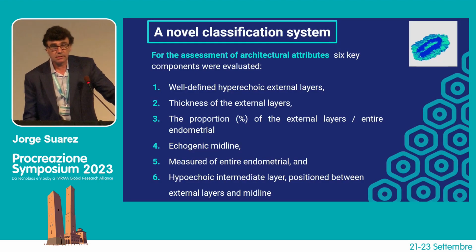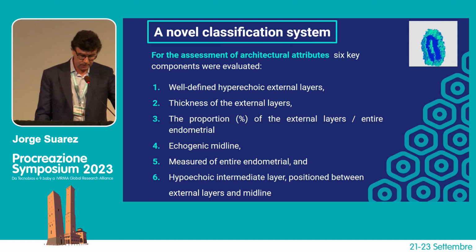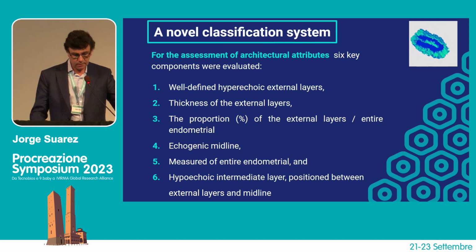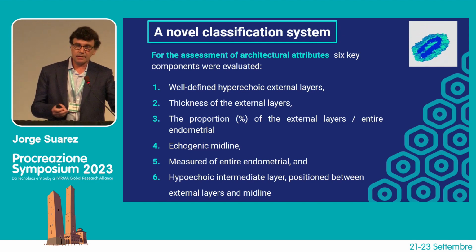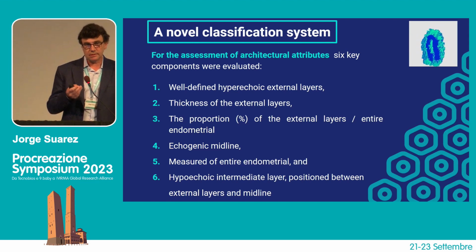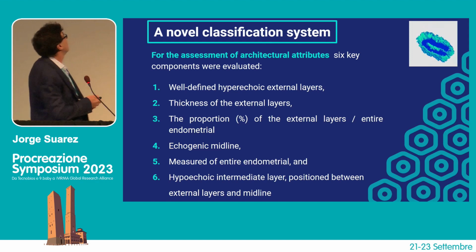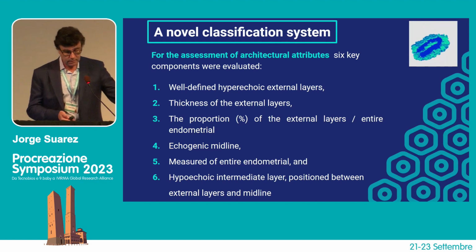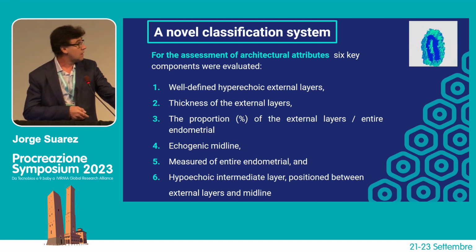So, taking into account this previous hypothesis, we can go for assessment of the architectural attributes that we need to establish our system. We identify 6 key components. Yes? The first one is the well-defined hyperechoic external layer.